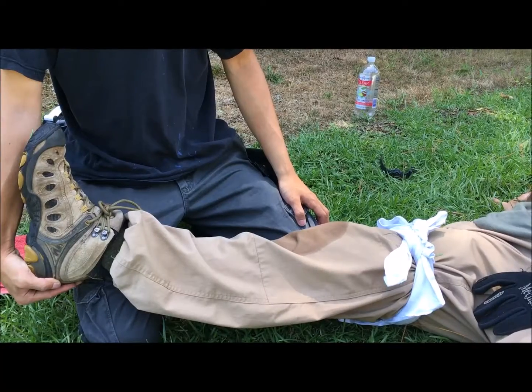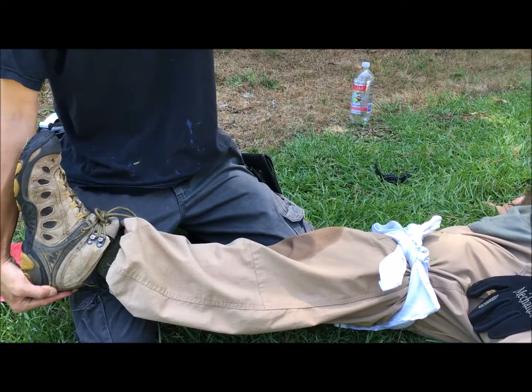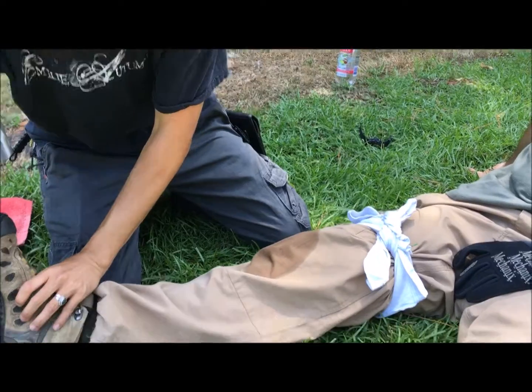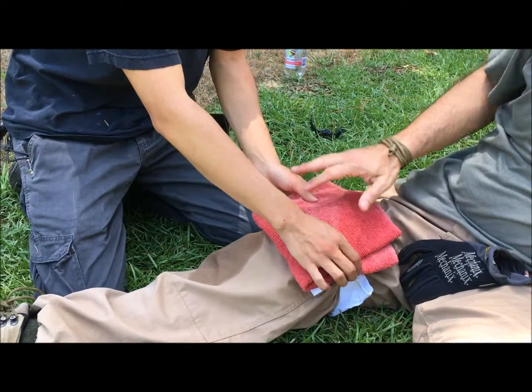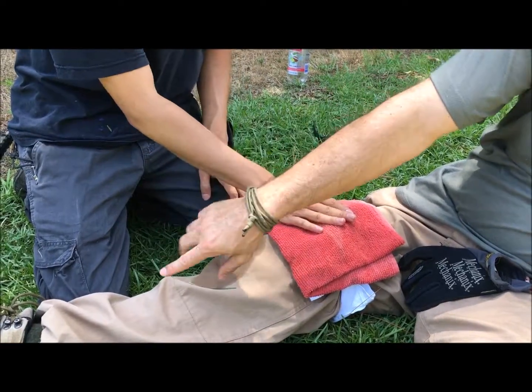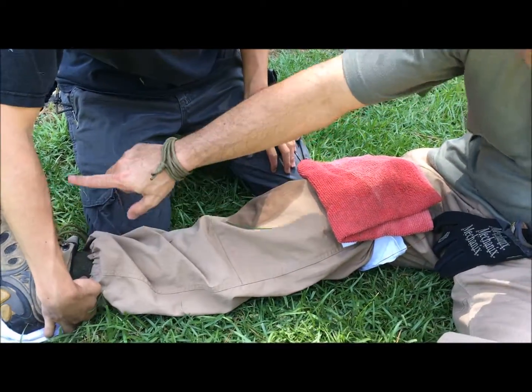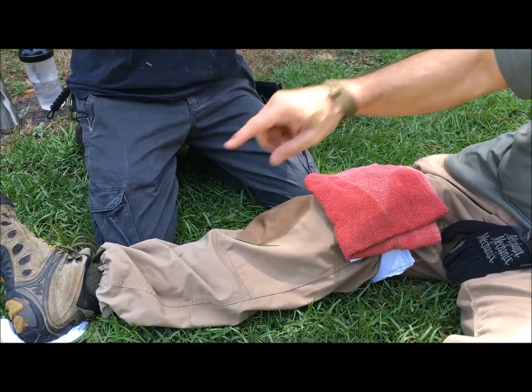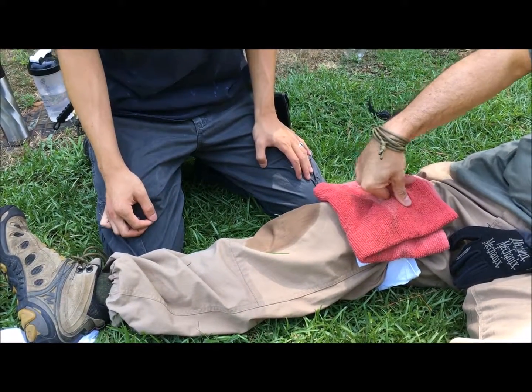5 to 10 minutes. And if it's still oozing blood, you're going to put the leg back down. You're going to put the pressure dressing on. Again, you're not trying to cut off circulation. You're also going to have to check for pulse in the leg, and also capillary refill on the toe. We're not going to do that. Because if you don't get it, this is too tight, and you've put on a tourniquet accidentally, because you're trying to save a limb at this point.